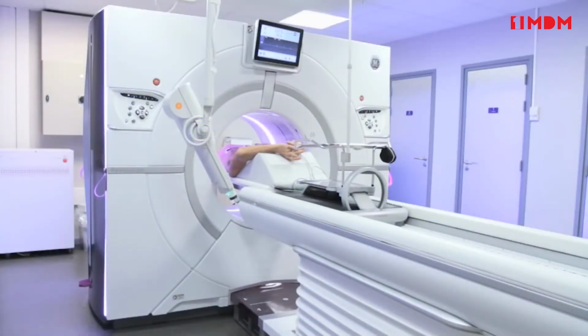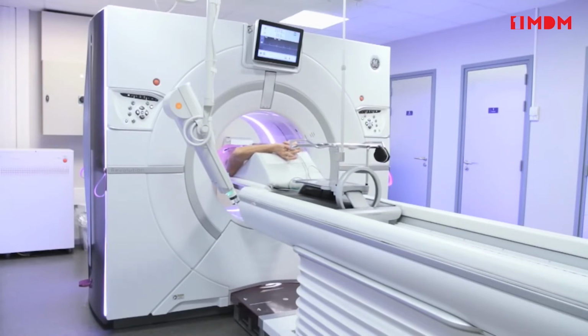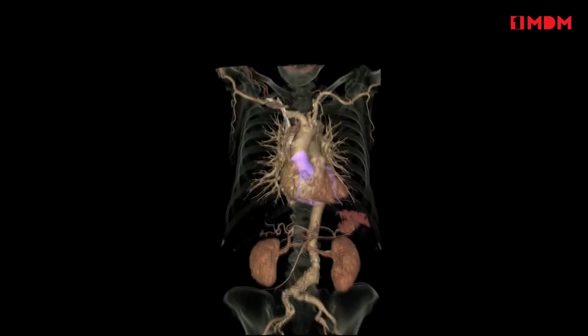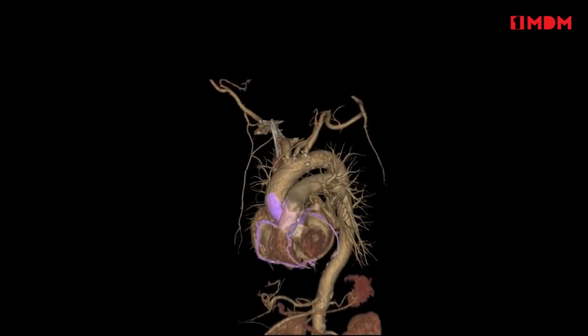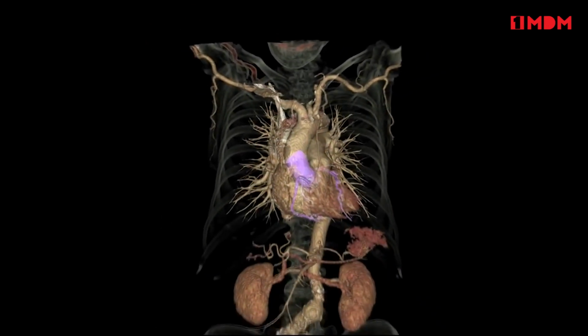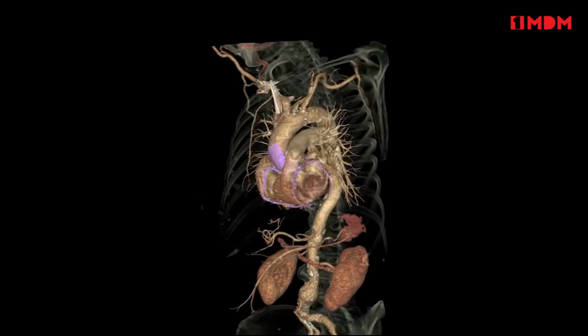One of the keys is that Revolution CT allows you to quickly switch between multi-volume gated axial and fast non-gated helical scans seamlessly. The result? You can generate excellent image quality for both the coronary arteries and the entire aorta at low dose without having to ask the patient to hold their breath for an extended time.